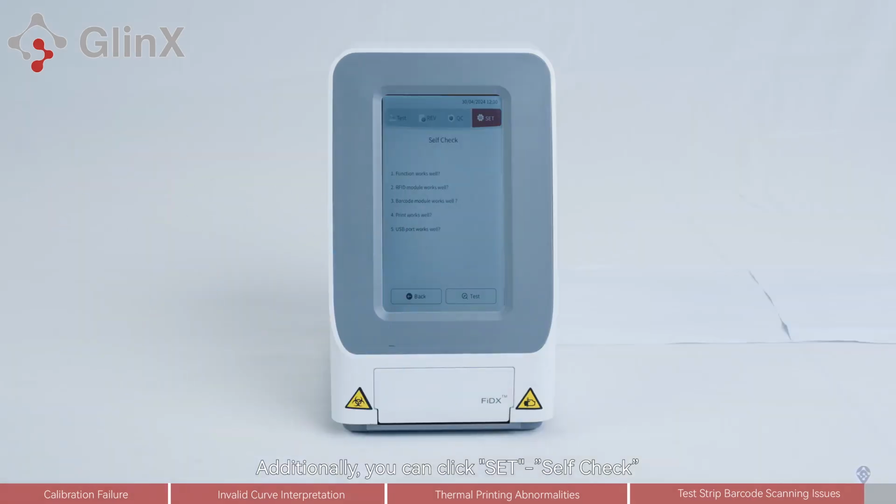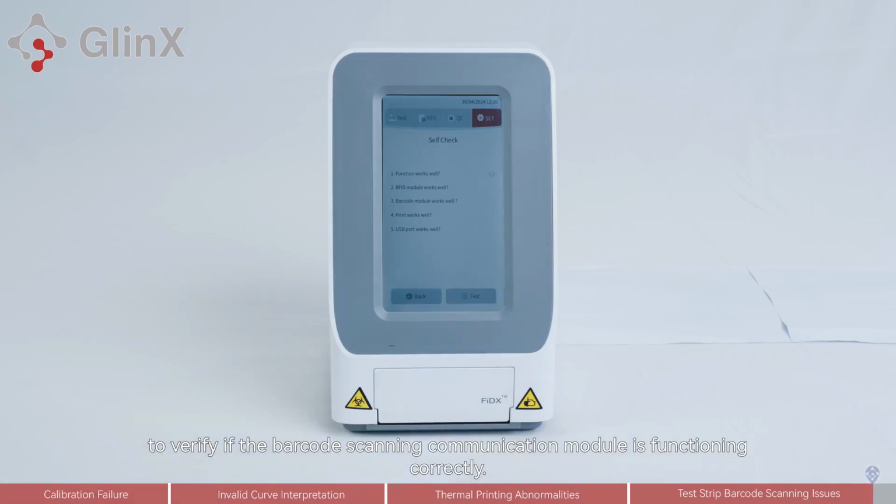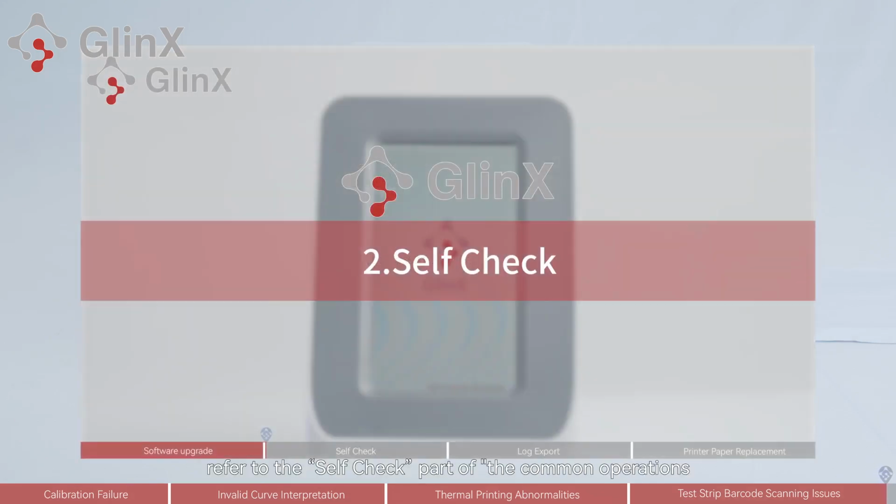Additionally, you can click Set, Self-Check to verify if the barcode scanning communication module is functioning correctly. For specific instructions, refer to the self-check part of the Common Operations of the FiDX Fluorescent Immunoassay Analyzer video.